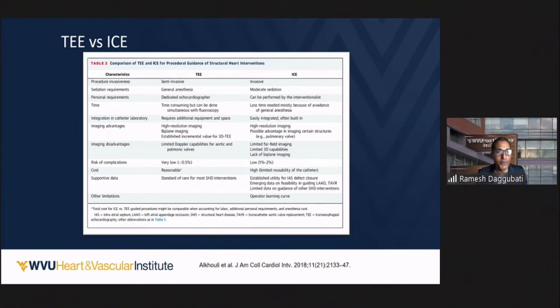From the patient viewpoint, it doesn't really matter what we have done, so I would take it with a grain of salt. If you really want to be trained in ICE, we definitely think it is possible to do it. And we do cases occasionally on ICE now as well, but not as much as previously, because there is limited far-field imaging, limited 3D capabilities, and lack of biplane imaging at the same time. Complication rates are comparable, but even if it is less than 0.5% with TEE and having even 1 to 2% complication from ICE, you can see whether it is acceptable.